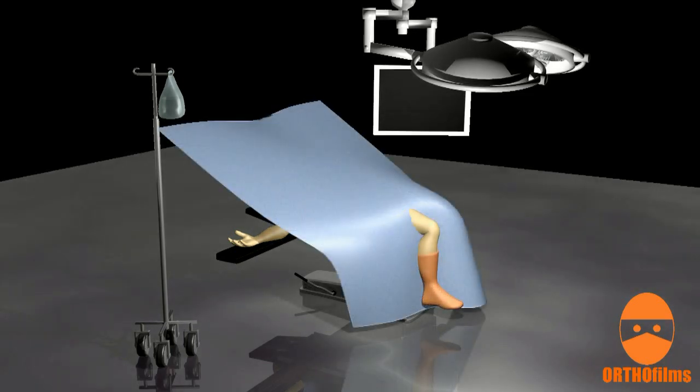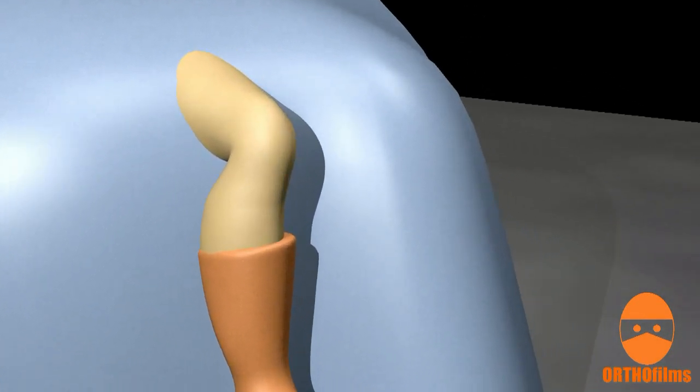Small incisions are made for use as portals for the water, camera, and instruments.